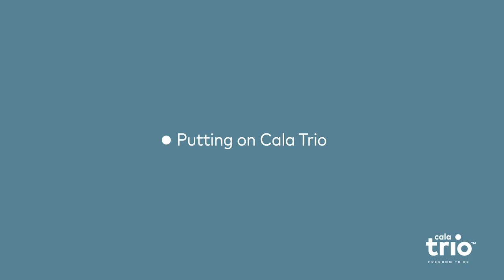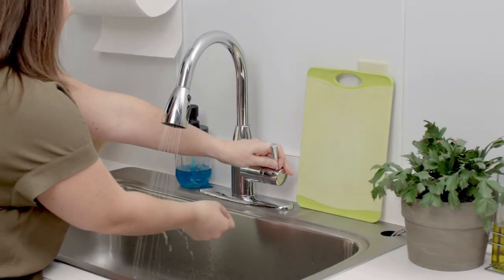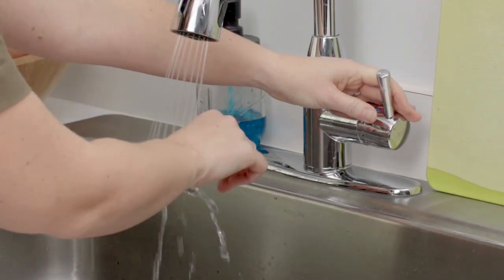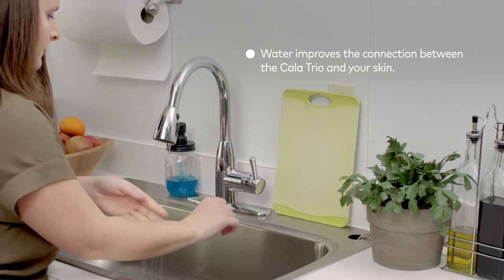Before putting on Calatrio, you need to apply water to your wrist. The most effective way to do this is by running your entire wrist under a faucet, like this. The application of water is essential in creating a connection between the Calatrio and your skin.